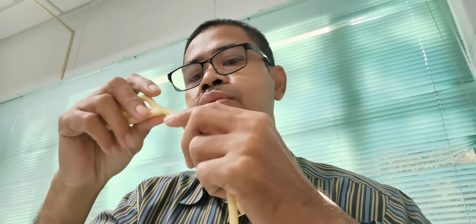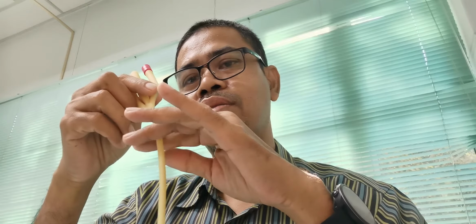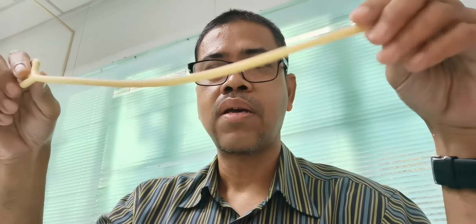Alright, sometimes complications do occur because some of you use sodium chloride, so they cannot deflate the balloon. The problem is the crystals will occupy the small lumen here and cause obstruction. So sometimes you can see people cut the catheter just to release the obstruction. That is wrong. Okay, that is wrong.